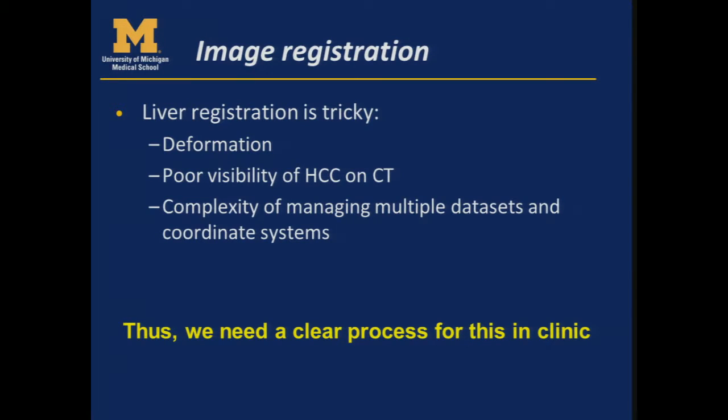So image registration. Image registration for liver tumors can be a little tricky, and that's why it's especially important for liver to have a very well-defined workflow that's very consistent, especially if you have multiple people handling that along the different steps along the path. It's very tricky for many reasons. One is that there's deformation of the liver, less so if you get an exhale and an exhale scan, MR and CT to register, but more so if you have an exhale to inhale scan that you're trying to mash together, one liver geometry to another liver geometry.